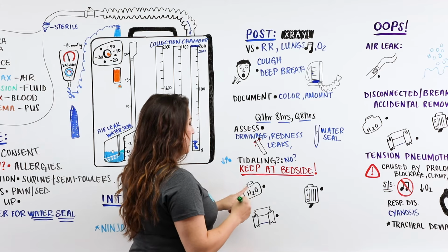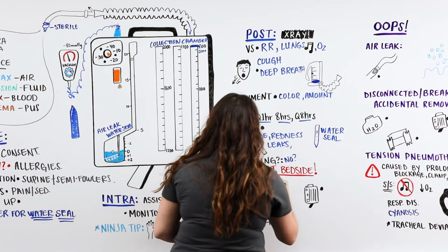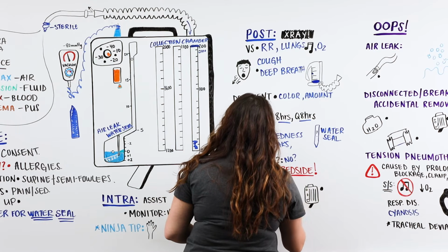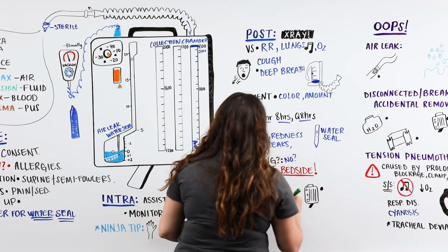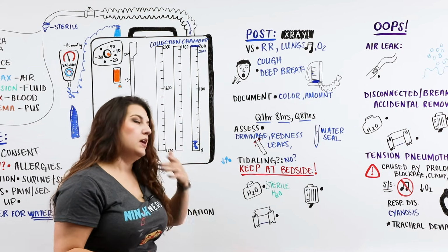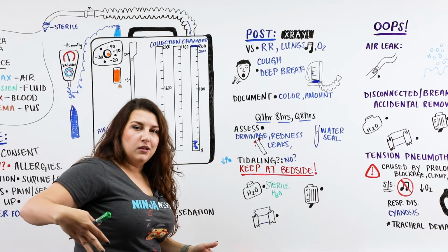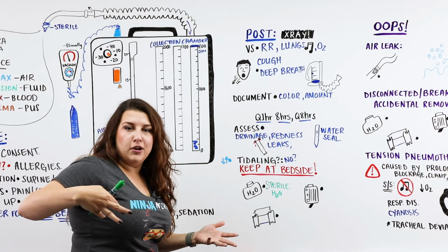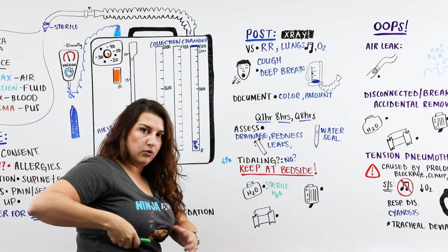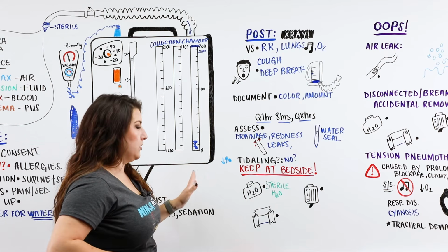The first is H2O, particularly a sterile container, right? And you're gonna be like, why do we need this sterile container of H2O? And that is because if there is some sort of dislodgement of the atrium from the chest tube, and you walk in and your patient just has a tube sticking out of their rib, you're like, what's going on? You can create a water seal by just taking the end of the tube and dunking that water right there. So that's able to create a new water seal until you get another atrium.